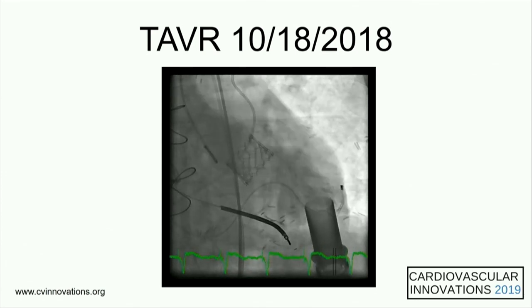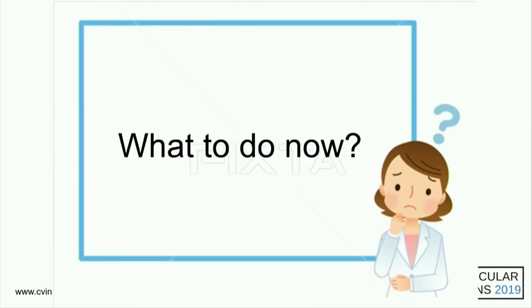So unfortunately, the valve is deployed at this point. We all stood there and said, well, what do we do? The heart failure specialist was there, interventionalists, anesthesiologists, we all discussed. And the patient was fairly stable, surprisingly. He did not require much more milrinone than normal. He was on his normal amount. There were no alarms on the LVAD, and we waited to make sure that the valve didn't move any further, that it was fairly stable. And at this point, we decided to just abort, do no harm, see how the patient did clinically, and bring him back if needed.